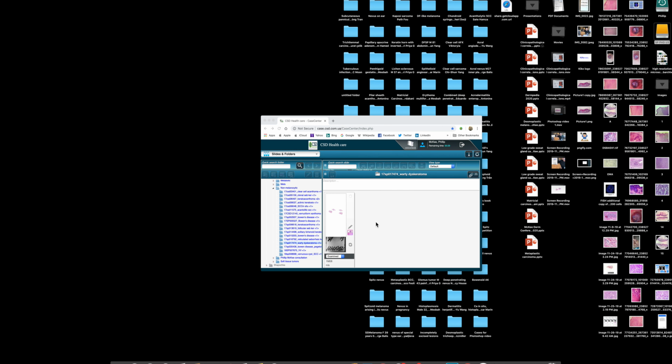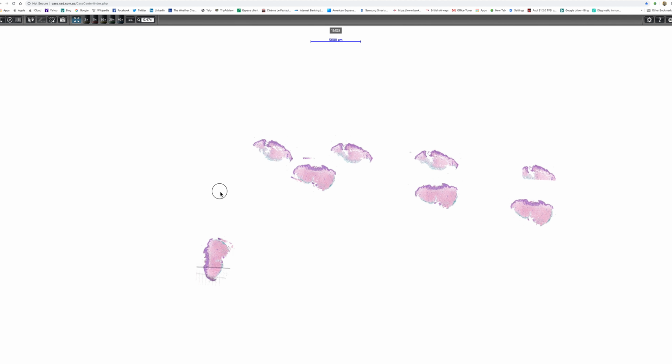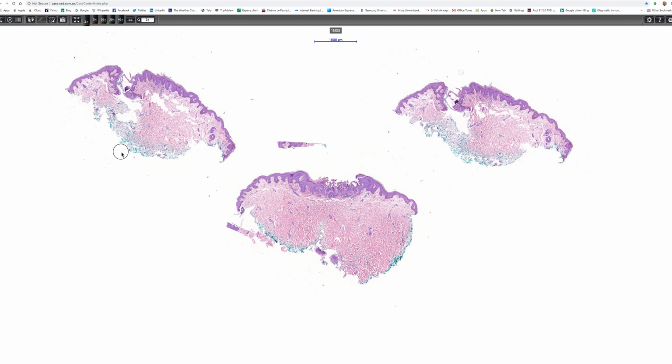A very pretty case which was very kindly shared with me by Dr. Antonina Kalmykova of CSD Healthcare in Kyiv, Ukraine. And it's particularly interesting because it raises a series of differential diagnoses. But let's begin by looking at the lesion.